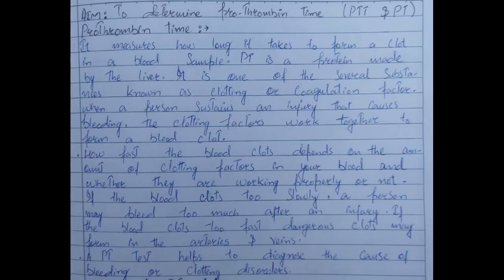आज का हमारा टॉपिक है प्रोथ्रोम्बिन टाइम, PTT एंड PT. Prothrombin time, it measures how long it takes to form a clot in a blood sample. ठीक, ये क्या मेजर करता है? ये मेजर करता है कि एक ब्लड सैंपल को कितना टाइम लगेगा क्लॉट बनने में.